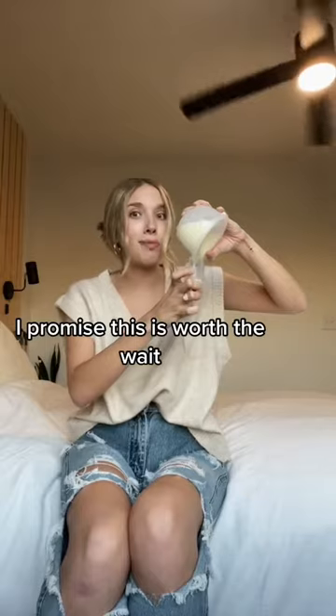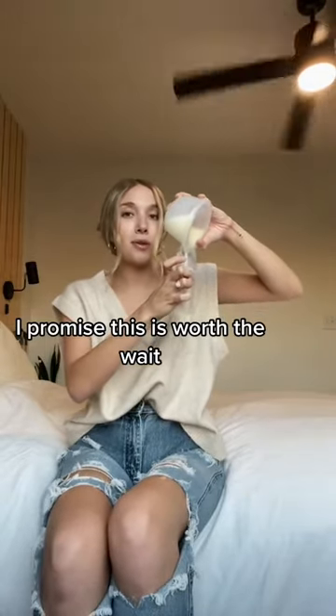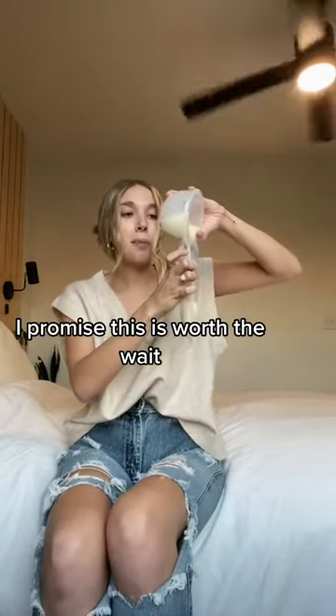I'm pouring, I'm pouring. I'm spilling a tiny bit. We're pouring, we're pouring. I promise this is worth it. If I could stop the recording right now, I would, but I only have two hands. Please, bear with me.